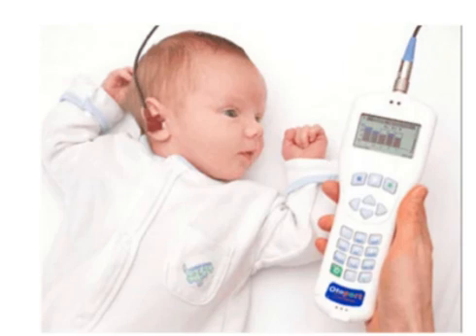Higher frequencies propagate a shorter distance along the basilar membrane to the base and need a shorter latency, whereas lower frequencies travel further towards the cochlear apex and require a longer latency. Stimulus frequency OAE, SFOAE, is evoked by a single pure tone stimulus. However, the response emission occurs at the same frequency as the stimulus and is hard to distinguish from residual stimulus energy. Thus, there is limited clinical use for this technique.